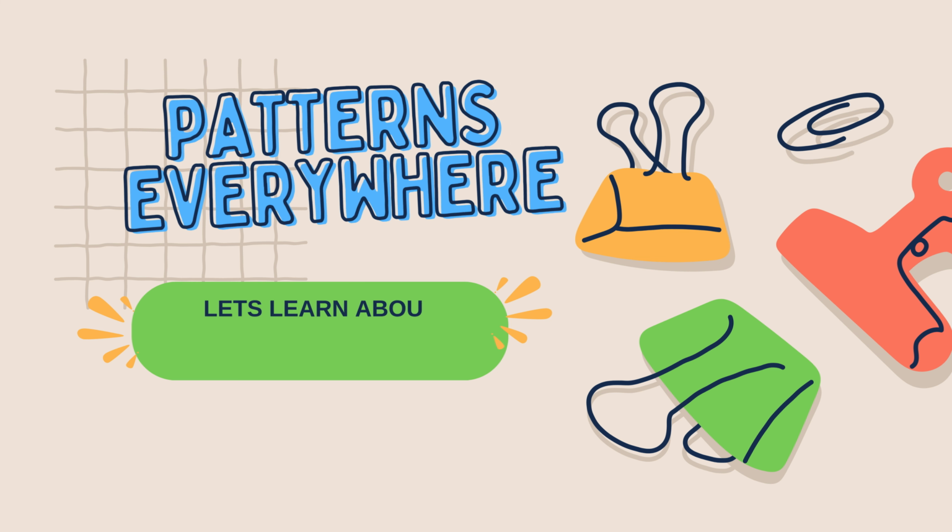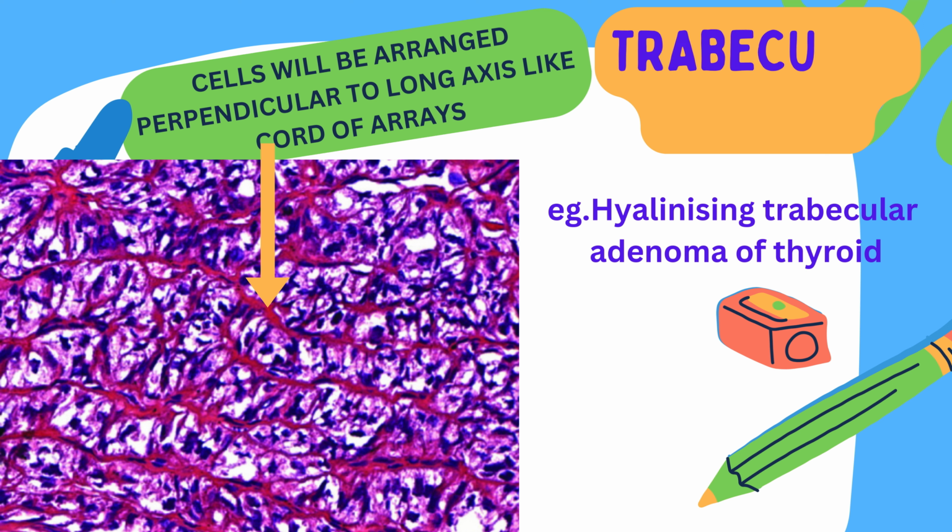Ever wondered how tiny patterns under the microscope reveal big disease secrets? From papillary to glandular, histopathology is like a puzzle waiting to be solved. Let's dive into the fascinating world of tissue patterns. Explore with me now. First one is the trabecular pattern.